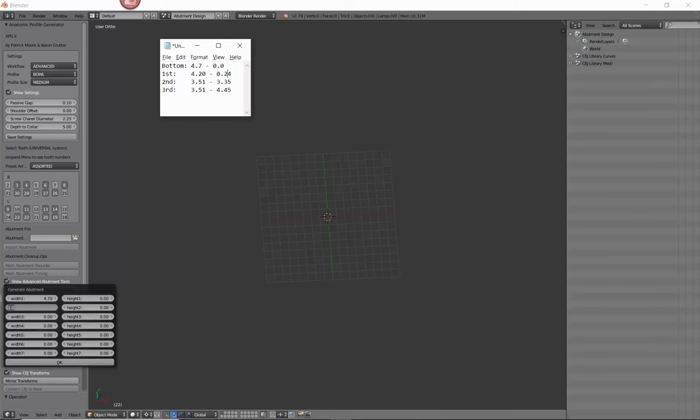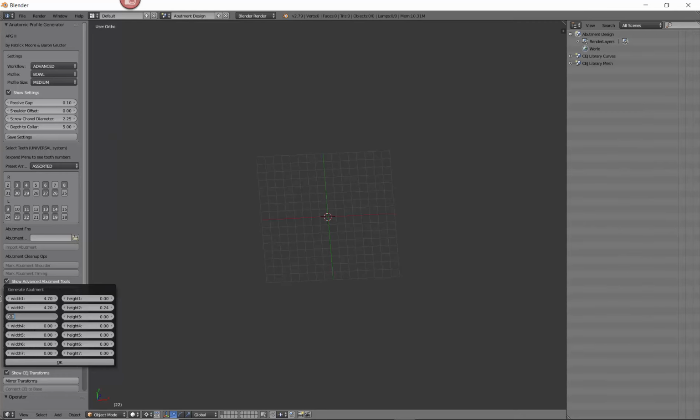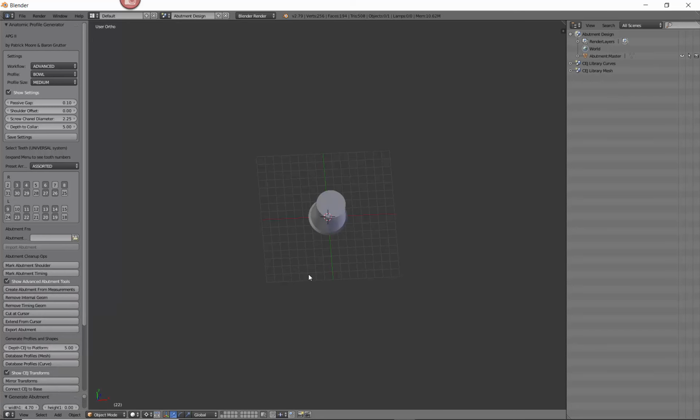So this one was supposed to be 4.2 at 2.24. Next one is going to be 3.51 at 3.35 height. Last one, 3.51 at 4.45. And if I click OK, there's my abutment.